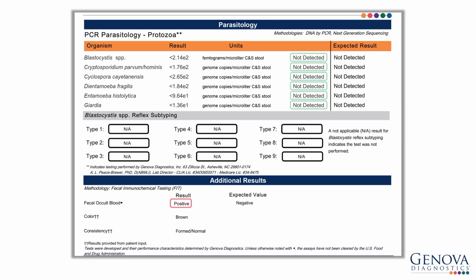That lab ran an acute diarrhea panel, which did not include a culture, and probably why the Aeromonas wasn't found until now. Lactoferrin is another add-on marker of neutrophil-mediated inflammation, but was not added on here. We do already have the Calprotectin, which is a marker for neutrophil-mediated inflammation, and we did see that that was elevated with this patient.